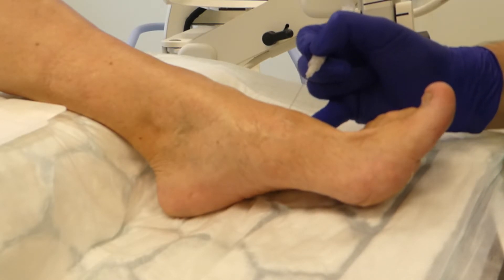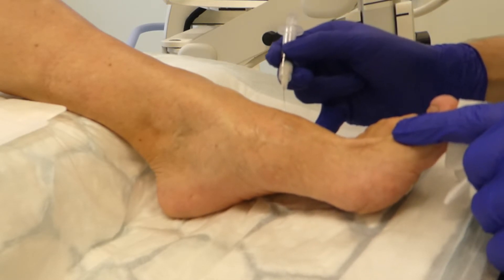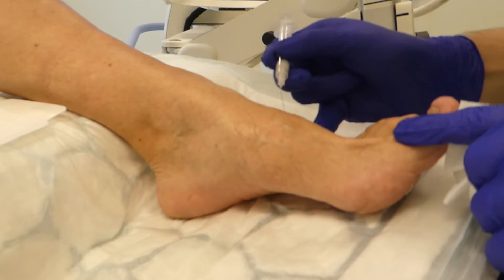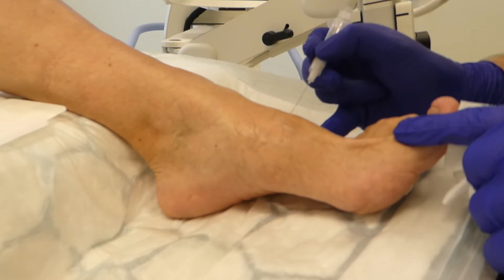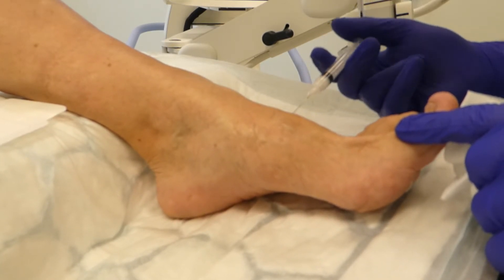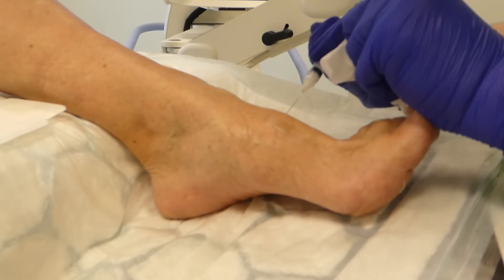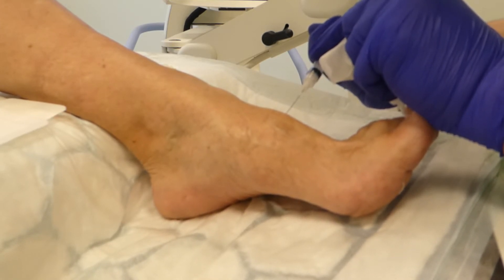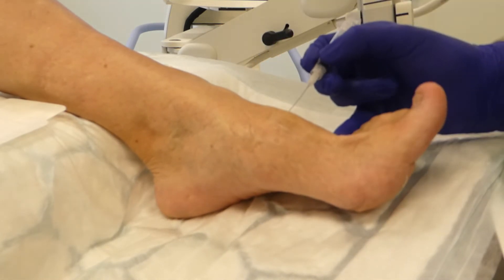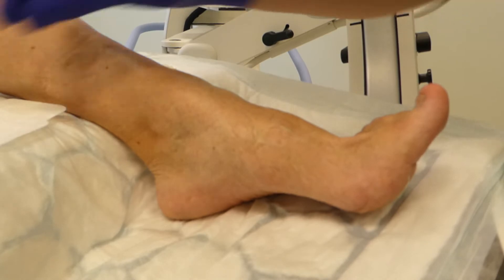Okay Pat, little scratch — three, two, one, out. Okay, that's really close. I'm just trying to find right in that joint — I'm actually just going to come out a little bit and come in there on the top. Oh, that felt it — that was good. We just had a little bit of patient feedback there but she didn't swear because she's ever so well brought up. I wanted to show you where the needle placement is on the top.